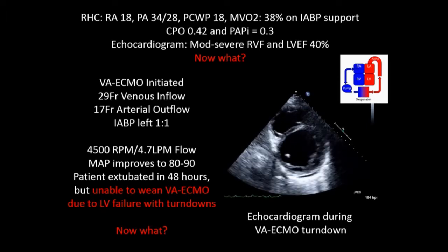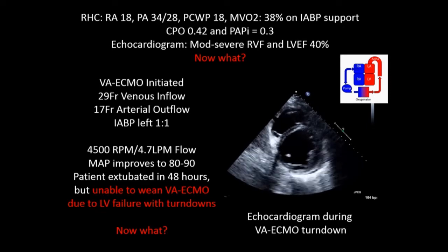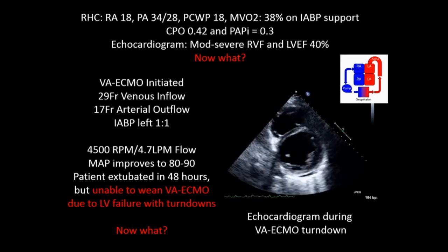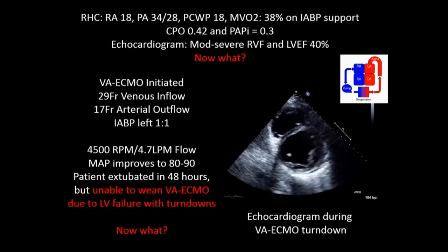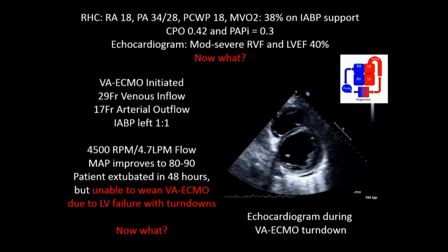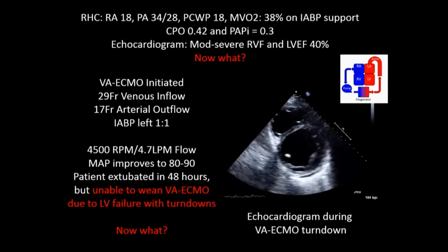Okay, BiVAD to recovery. So, surgical BiVAD, right? Unload the ventricle with an impeller. Okay, so you've got a balloon pump in, right? Supposedly that should be venting, but you could upgrade. There's no septostomy at this stage, no? So you could do, again, as Maurice had indicated, this idea of a passive unloading with a pop-off valve.